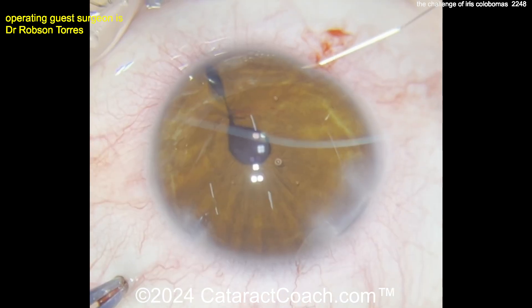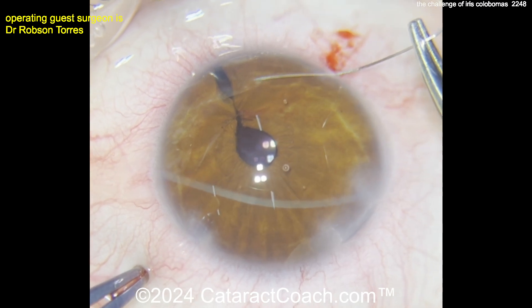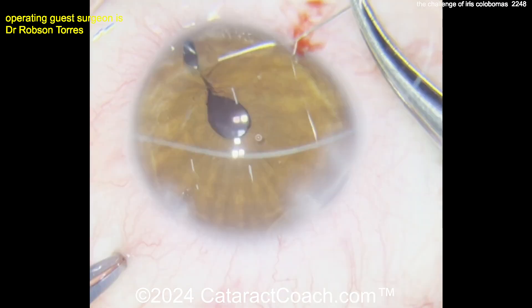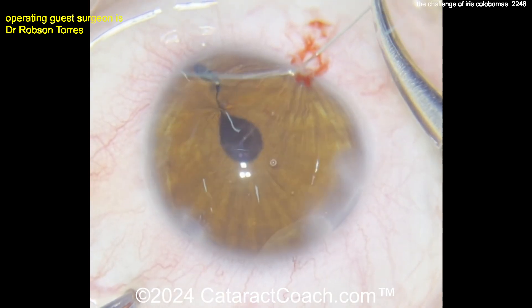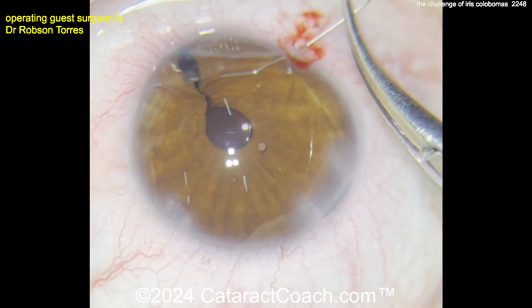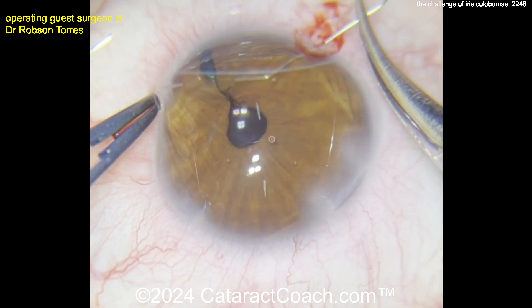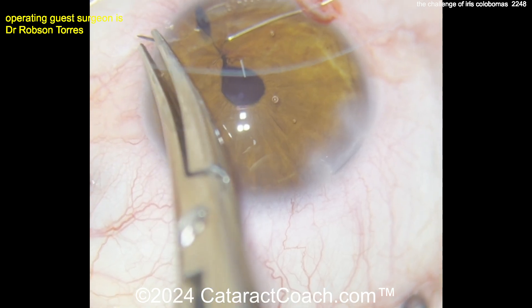To re-center the pupil, some surgeons will do a sphincterotomy — on the opposite end of the coloboma, making a few snips in the iris margin. That certainly works. But the surgeon here has an interesting technique: using a little bit of endocautery to shape the pupil and shift its position. There's that 10-0 polypropylene being pulled through.